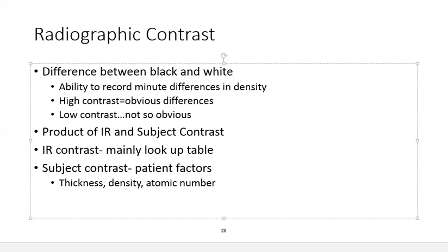Once you collapse the lung tissue and get rid of some of that air, whenever you have an atelectasis and the lung collapses, then you get consolidation of that lung, and the lung actually increases in density because you're lacking the air. We tend to mistake pneumothorax.